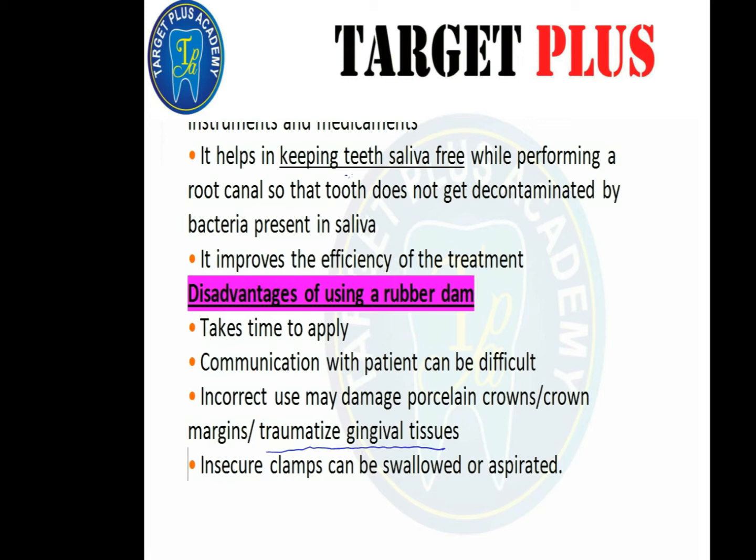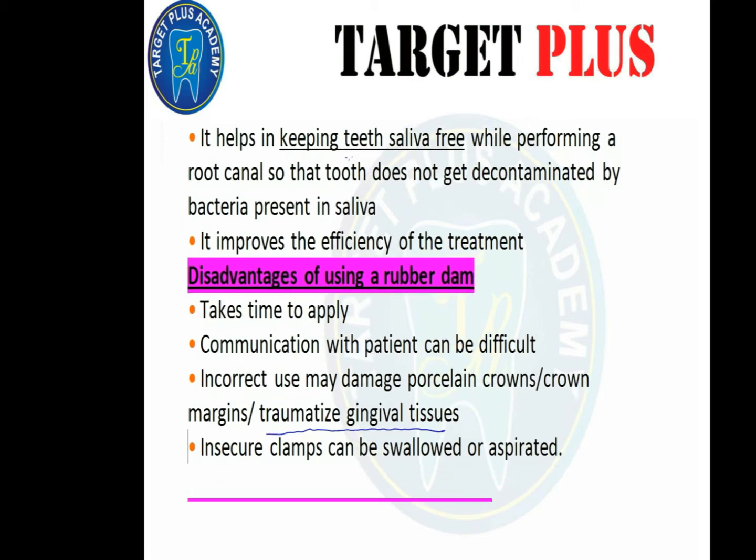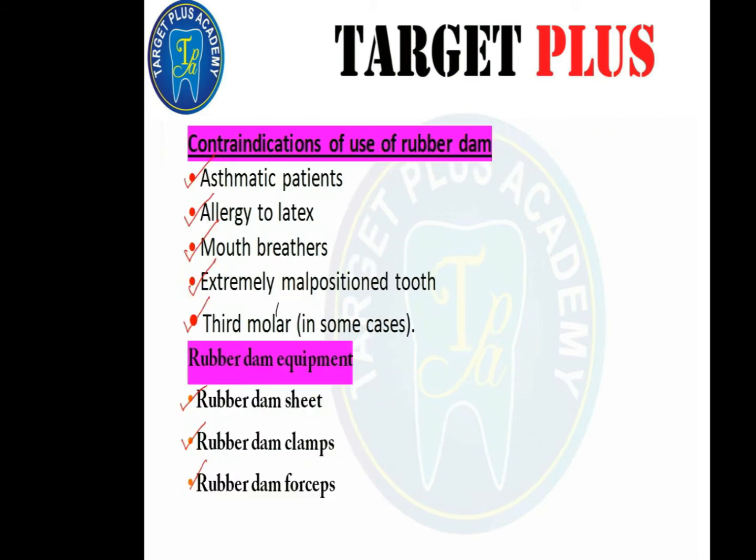Now, what are the disadvantages of using a rubber dam? It takes time to apply. Communication to the patient can be difficult. Incorrect use may cause damage to the porcelain crowns and margins. Clamps can be swallowed or aspirated.